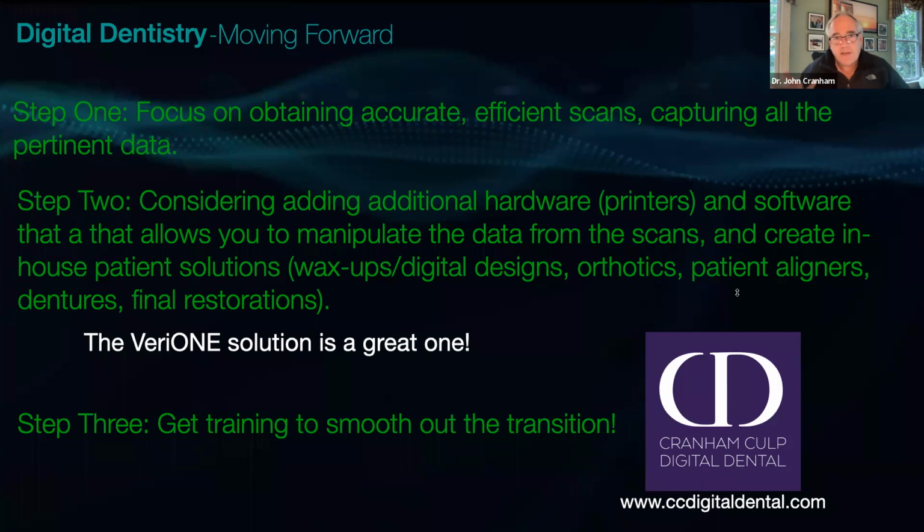So the first thing we did was a soft line. We roughed it up, put the adhesive in it. We use a soft line, just called soft line from Kerr, and put it in, border mold it, get a good impression, did the same thing to the bottom, and then adjusted it so that in centric, it was hitting pretty even. And then what the team does is they take the denture out of the mouth, and in their hand, this is what's important, in their hand, they scan both sides of the denture, intaglio and all the teeth, do the same thing with the other one, then put it back in their mouth and scan the bite. And when they do that, now the lab can take that data and take it into the denture workflow, which is inside of 3Shape, and start from there.